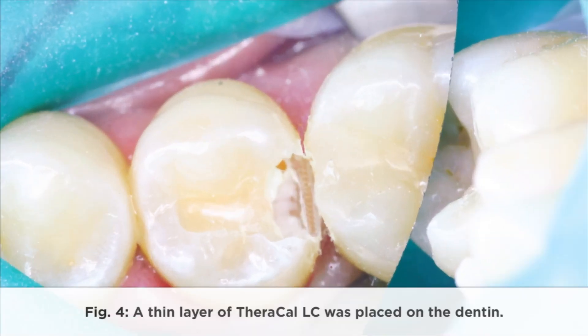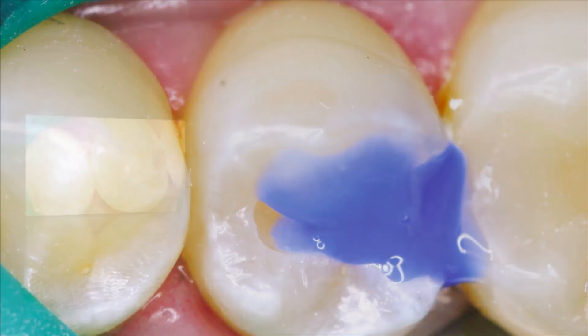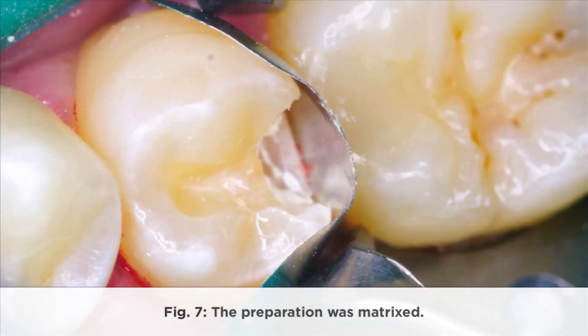A thin layer of TheraCal LC was placed on the dentin. Excess liner was removed using hand instruments. The preparation was etched, rinsed, and coated with adhesive. The preparation was then matrixed.